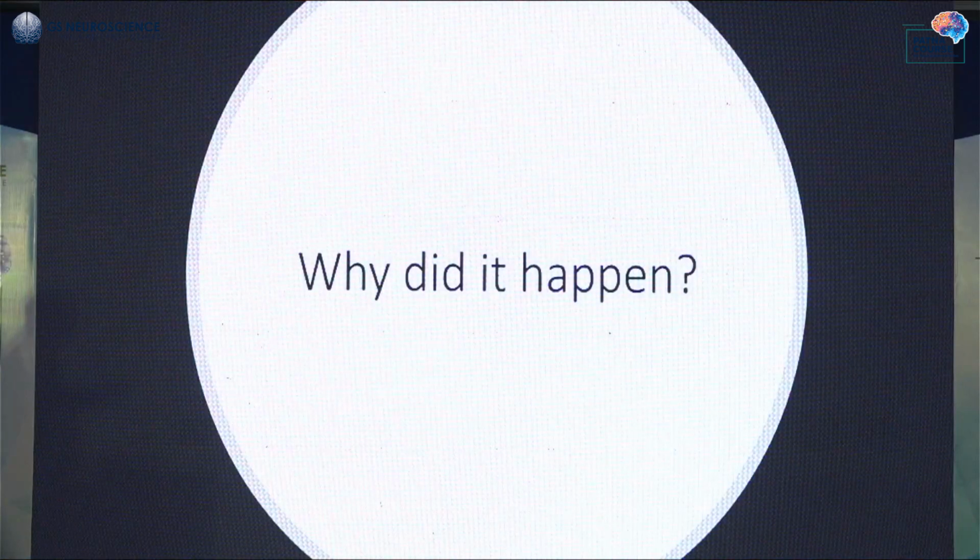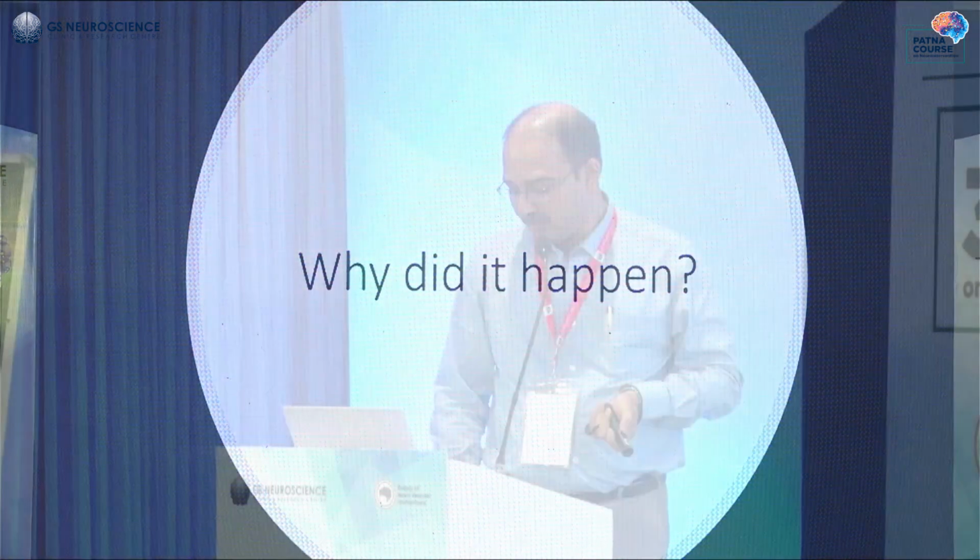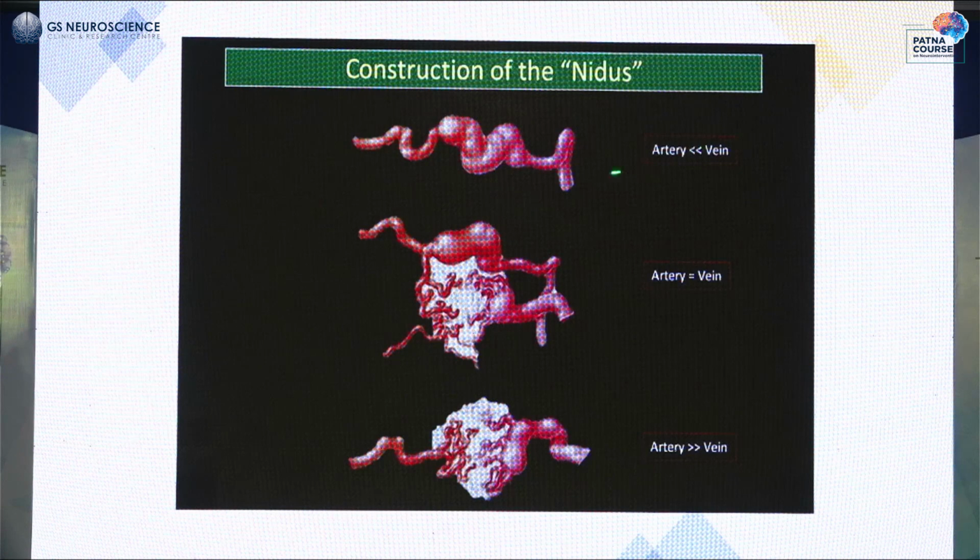So why did it happen? Why did the glue flow so fast, though we were on the higher side of concentration, we used 50%? This is again his teaching, that when it's a fistula sort of a connection, it flies off very fast unless you are wedged eccentrically. So even 50% would fly off. So that is what has happened.